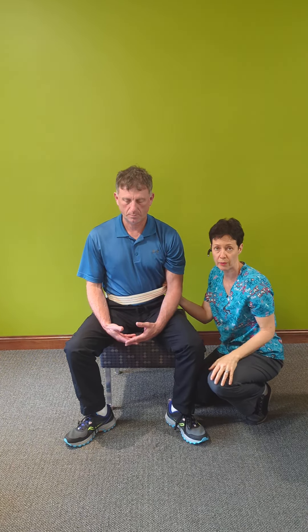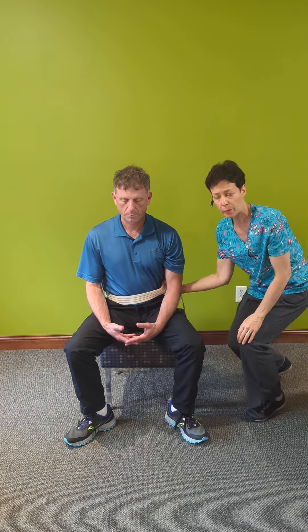Steve is going to be my mock patient. He and I have a 50-pound difference, so it's really important that I have a way to safely transfer him and not let him pull me forward and injure my lower back disc or my shoulder, which are the two most common injuries we tend to see among caregivers.